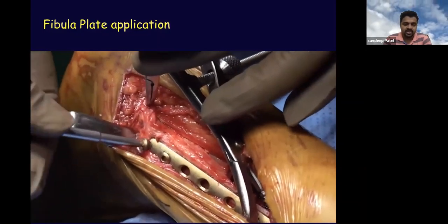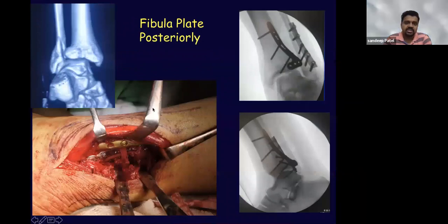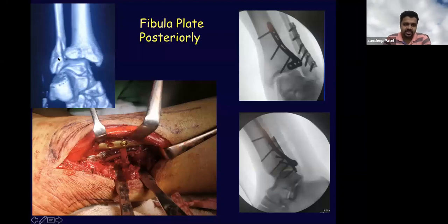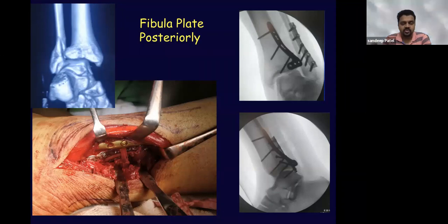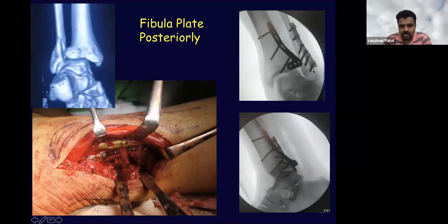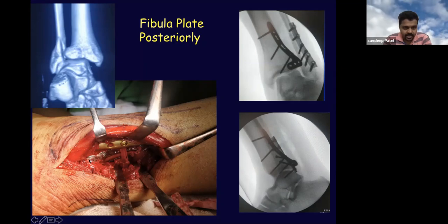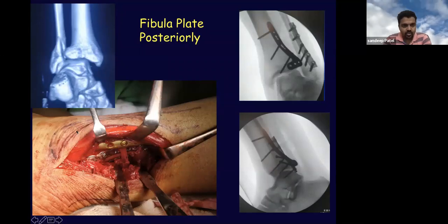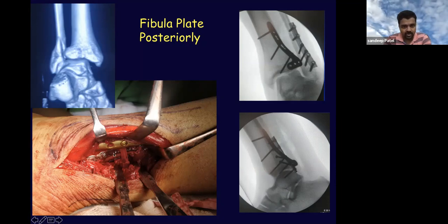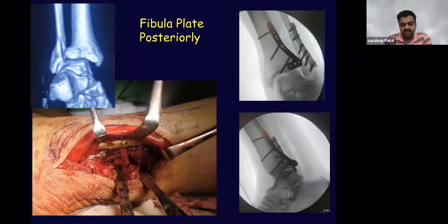In another case — a supination external rotation injury with a short oblique fracture — the best way is an anti-glide plate of the fibula posteriorly. You can see here how the fibular plate is applied from posterior: the posterior malleolar plate with an anatomical plate, and then the fibular plate in anti-glide mode applied from the posterior surface. This can be done medial to the peronei, though sometimes we may need to go laterally distally. This demonstrates that a fibular plate can be placed posteriorly if the fracture pattern permits.